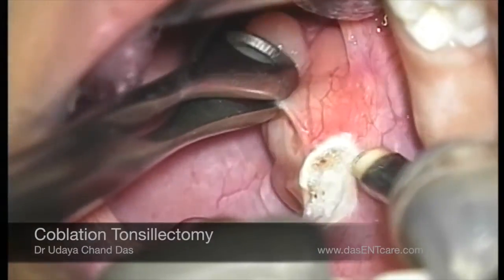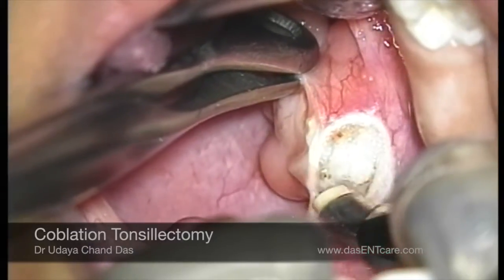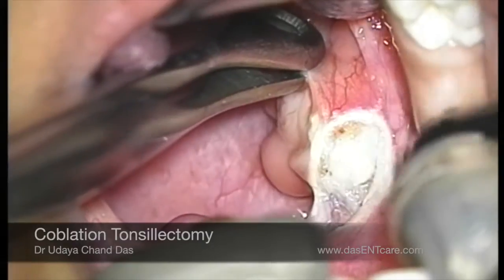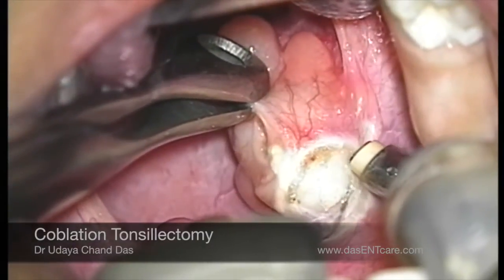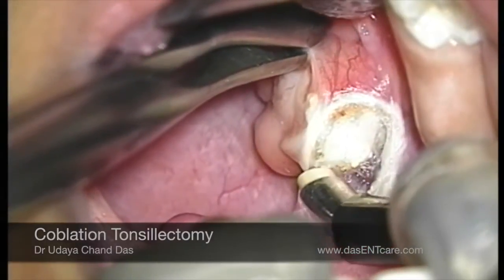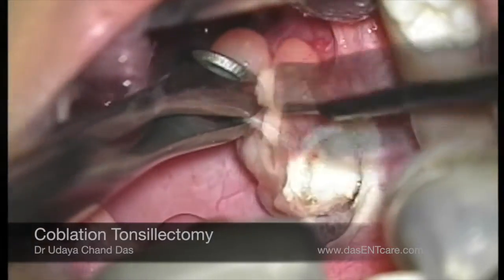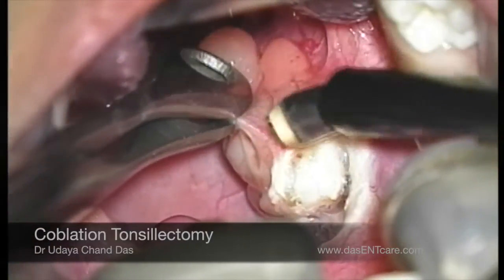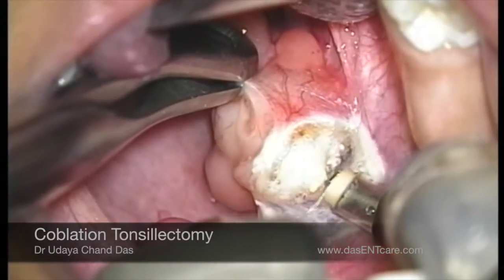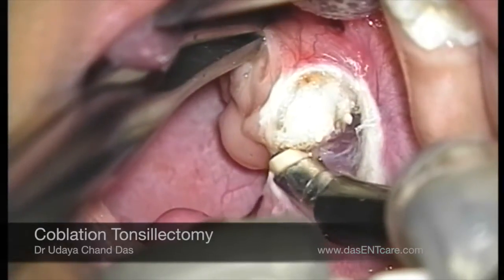This coblation wand is being used to dissect the tonsil. This wand has got three ports — one port carries saline to the field, pouring saline onto the tissues and reducing the temperature of the dissection area to just 60 degrees, unlike laser which cuts tissues at 600 degrees and can cause a lot of collateral thermal damage. This dissection is being done at around 60 to 70 degrees.